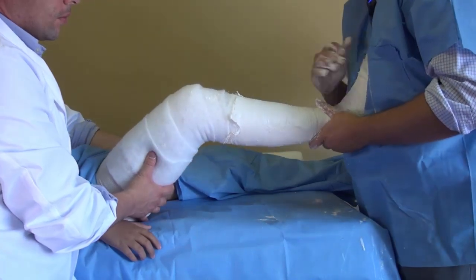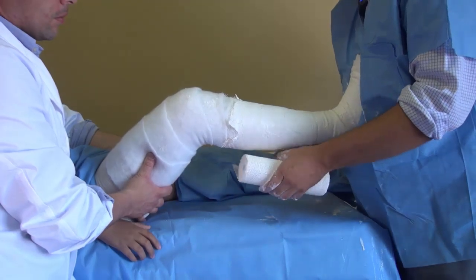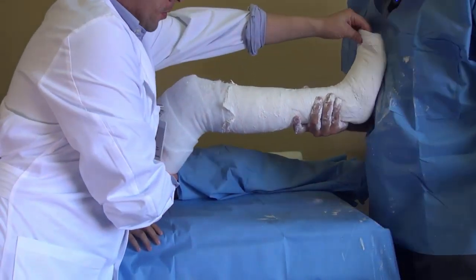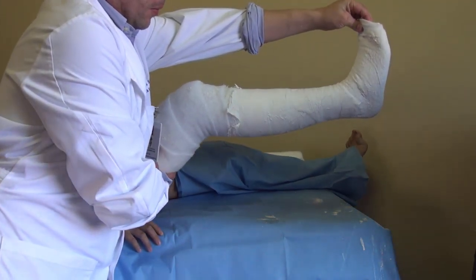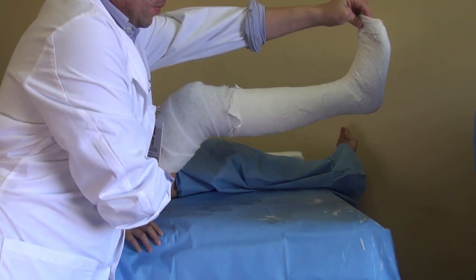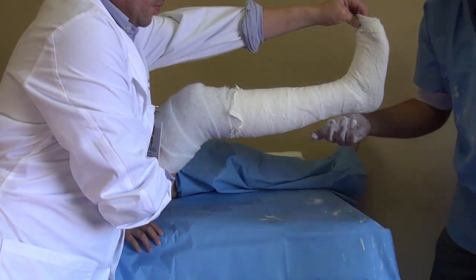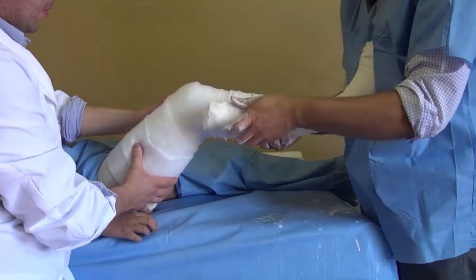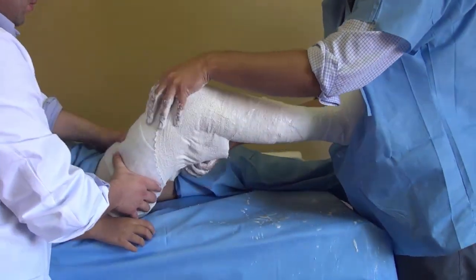Remember: 30 degrees flexion, 90 degrees at the ankle — watch out for equinus foot, that's a natural tendency when you put this cast. Leave 10 centimeters for the tip, get it wet, get all the bubbles out, let it drain by itself, don't squeeze it. Now we're going to start working around the knee — the knee is the weakest part of this cast, so we need it to be very reinforced.